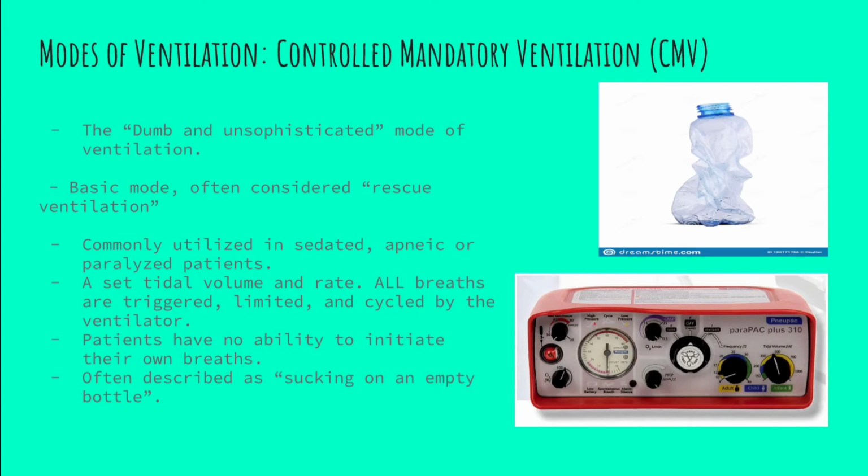So, as I mentioned, this is something that's used in the pre-hospital setting pretty commonly. It's used in emergency departments, and it's used within the hospital as a means to transport patients from maybe the ER to the ICU because it's not as big. You don't have to roll it behind the patient. It's pretty small. You can hook it up to a portable tank, lay it on the patient's lap, and roll the patient to the next room.